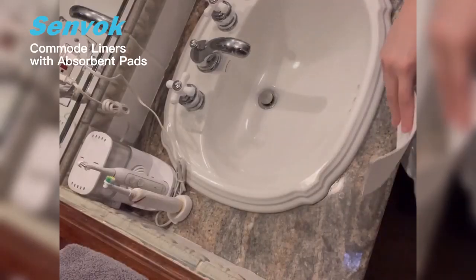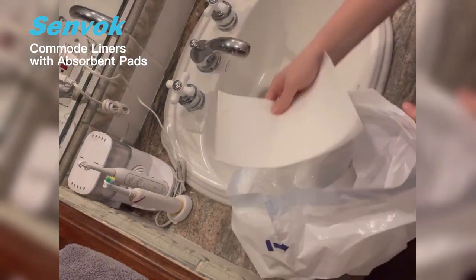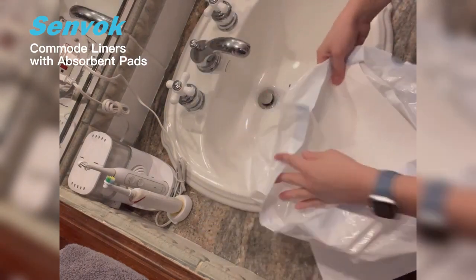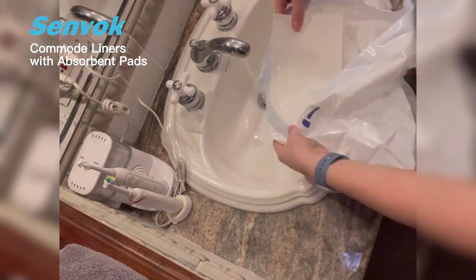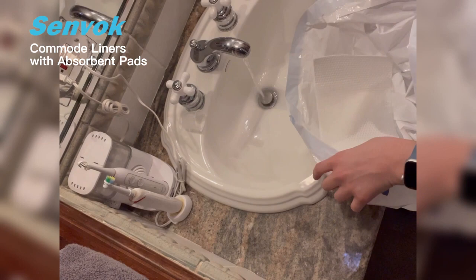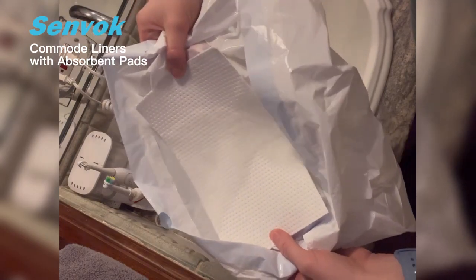So I want to show you just how quickly the pad turns into absorbent gel when it gets wet. Here is the pad that you put inside the bag — I'm just going to show you how quickly it absorbs the liquid. As you can see, the liquid quickly absorbs into the pad and turns into that gel bead so that it absorbs and there's no mess.